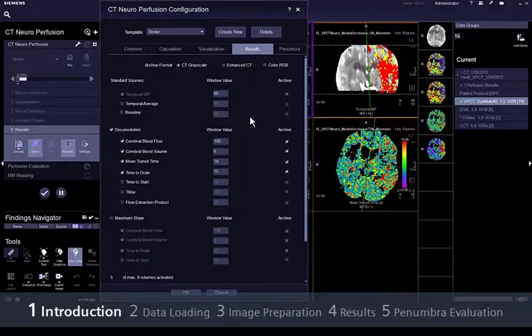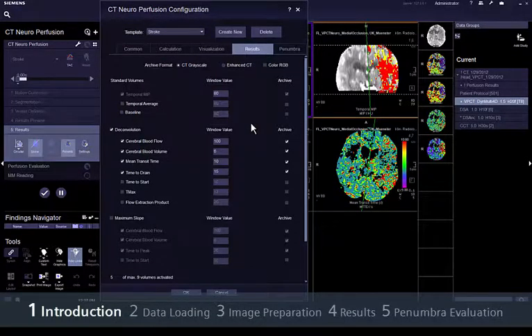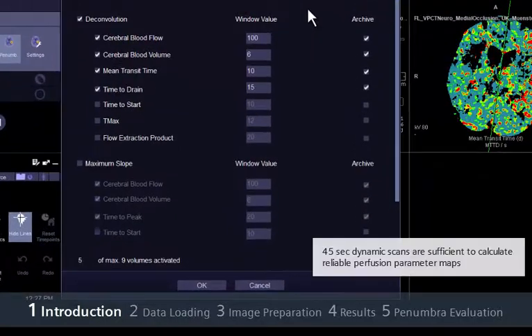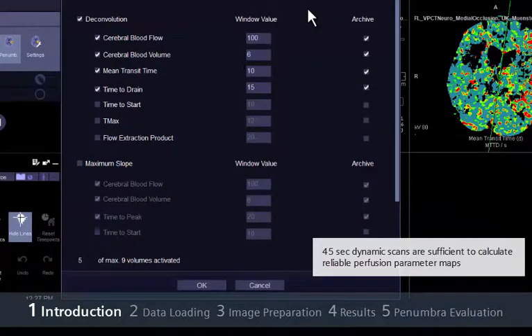Unlike most conventional deconvolution perfusion algorithms, the Siemens software does not need scan times as long as 60 seconds to calculate proper perfusion results, an important consideration in helping to reduce unnecessary radiation. Because of the advanced algorithms — a maximum slope model and an optimised deconvolution type model — 45 second dynamic scans are sufficient to calculate reliable perfusion parameter maps.